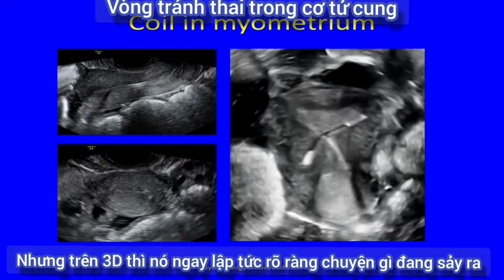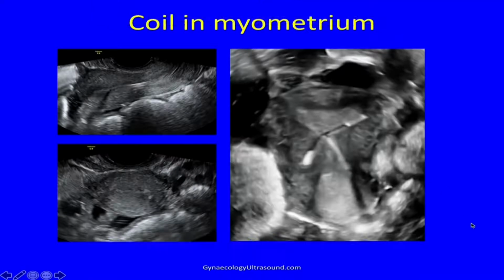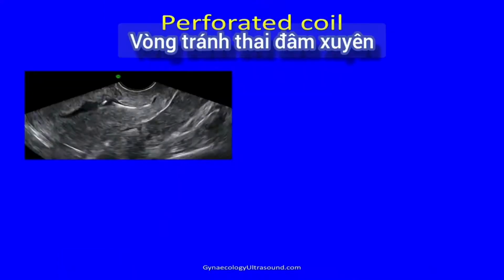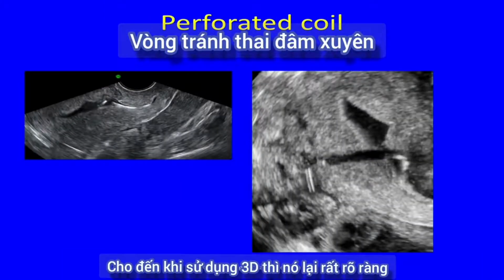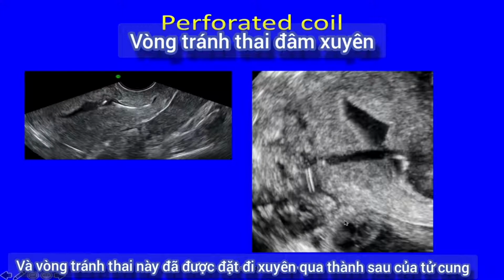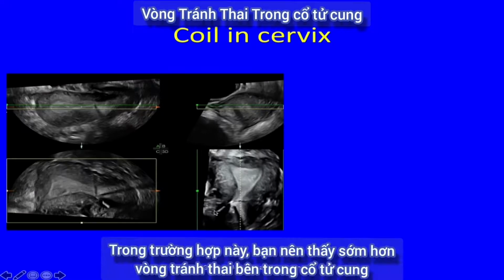But on 3D it's instantly obvious what's happened here: this coil, one of the arms, has perforated the myometrium. This Mirena is in sideways. And again here it wasn't at all clear what was going on until in 3D it was obvious. There's the cavity, this is the back of the uterus, and this coil has been inserted through the posterior uterine wall. In this case, as you saw earlier, the coil is in the cervix.